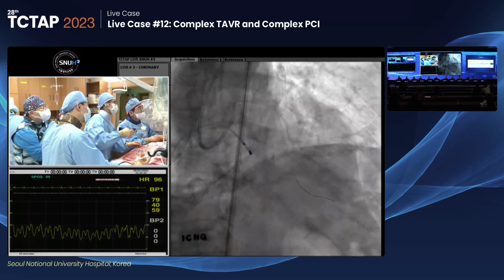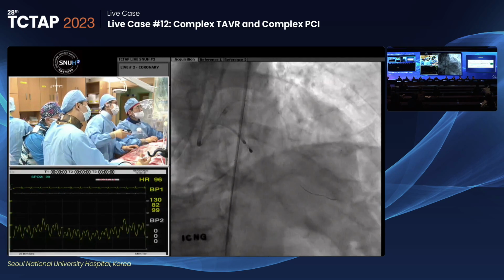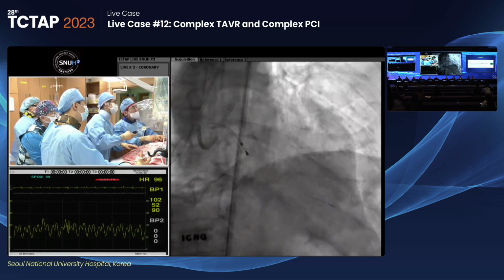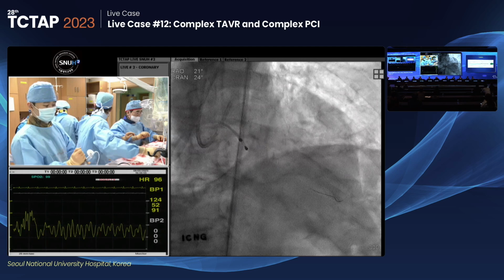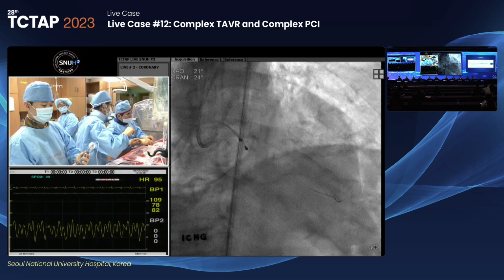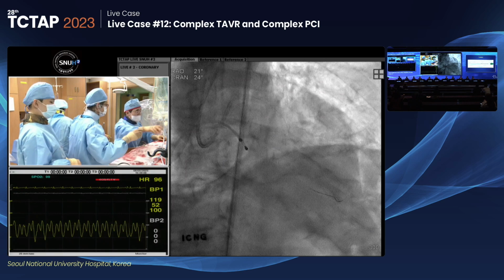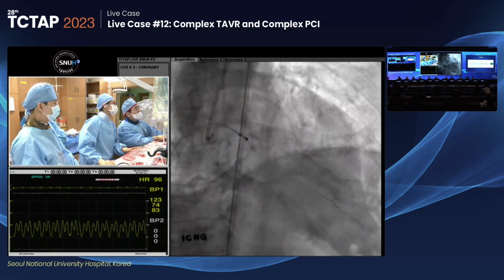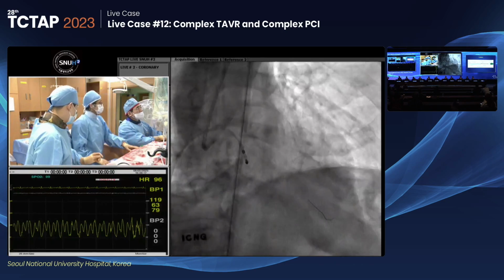It's okay. You have to dilate the stent more. Take a 3.0 balloon, 20 atmospheres approximately. Dilate the stent, and you can make room for the Guidezilla. You have time. He has never been so patient with me, you know. Dilate the stent very well, and then the Guidezilla will go down. Yeah, 3.5 balloon, 20 atmospheres.